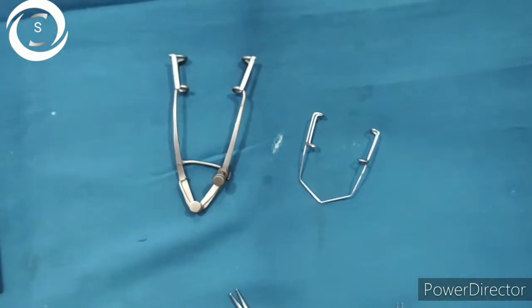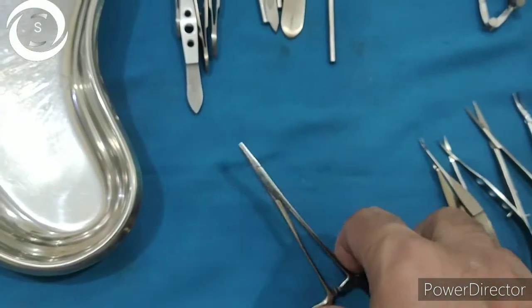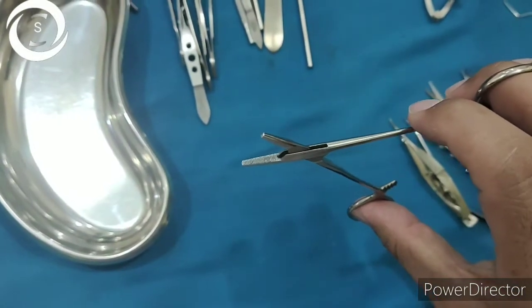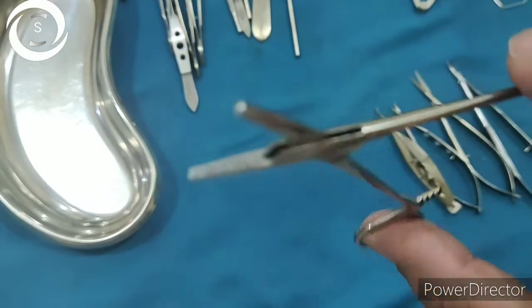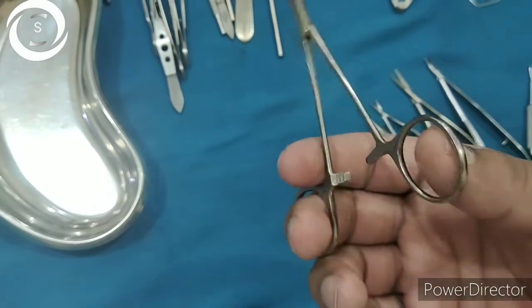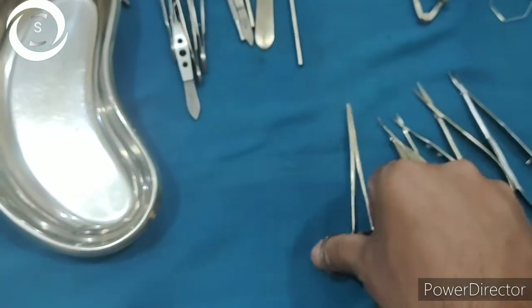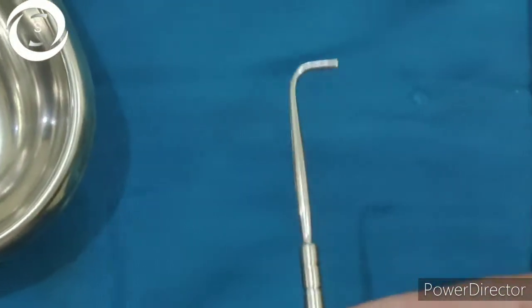This is the artery forcep, or hemostat. It has serrated edges and is available in curved as well as straight types. Here you can see a straight small size and a large size with a lock, used to stop bleeding especially in lid and DCR surgical procedures. You can see how it locks and unlocks.